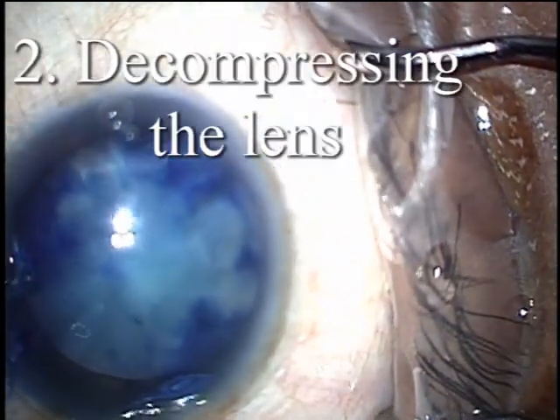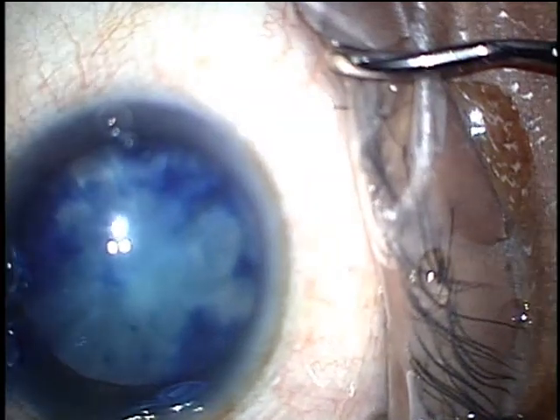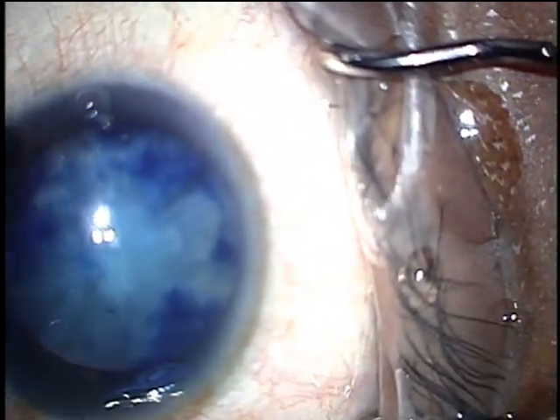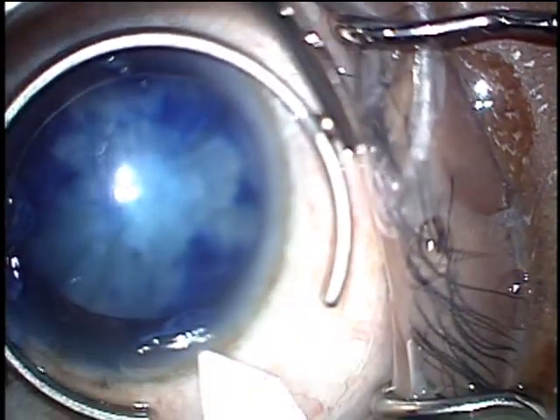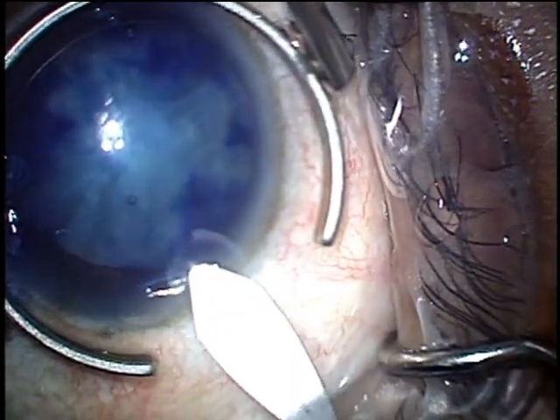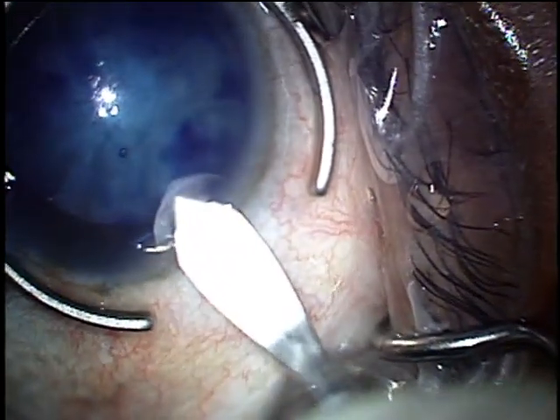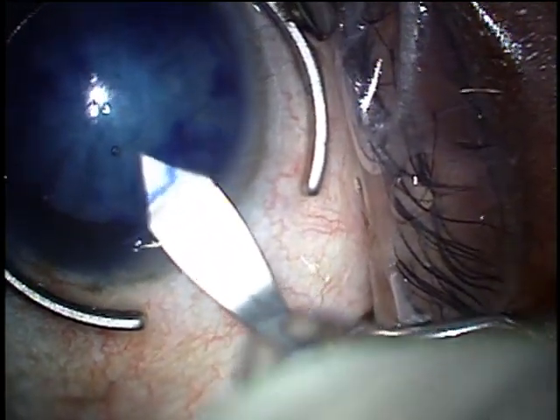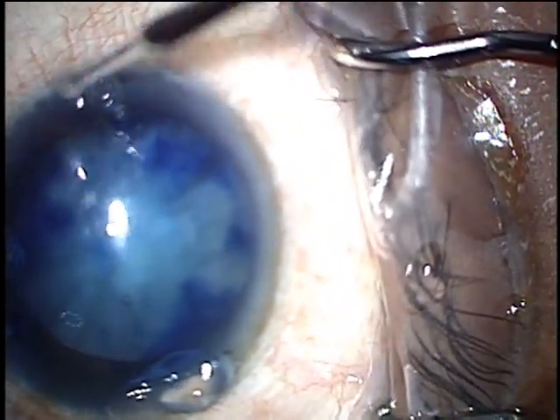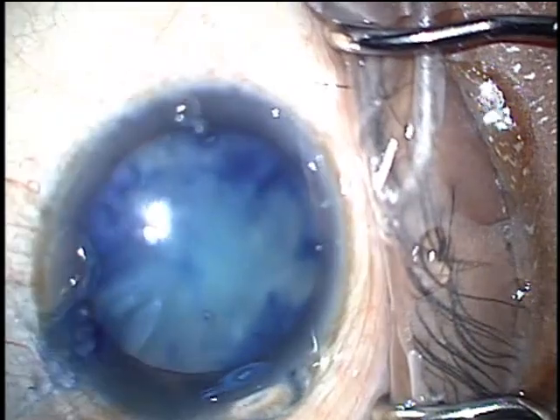To decompress the nucleus with the FACO probe, make sure your FACO machine is set to sculpt settings with low vacuum, continuous ultrasound, and normal bottle height. The goal is to make a circular central rent in the capsule, bury the tip in the cortex, aspirate, and then quickly get out.